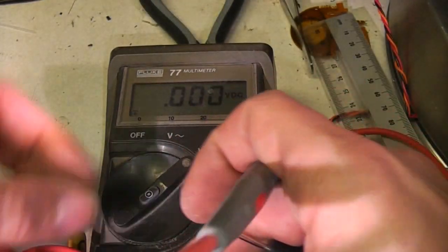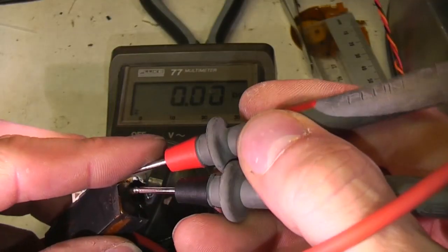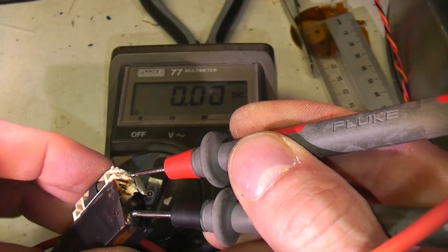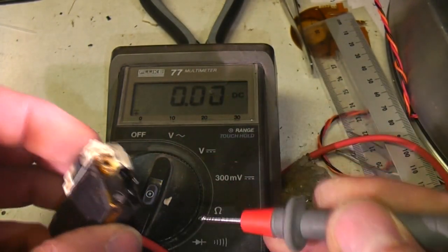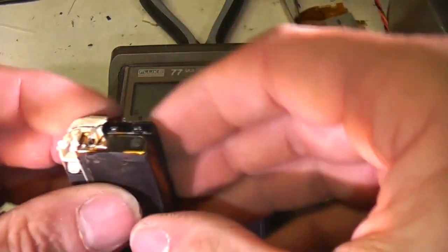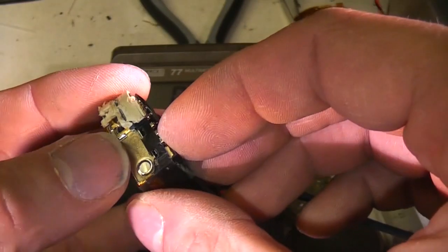Just see how much current it can put out. It's quite a lot. It's about 7 amp short circuit current. So I don't really want to be shorting that for too long here. Might try that outside later.